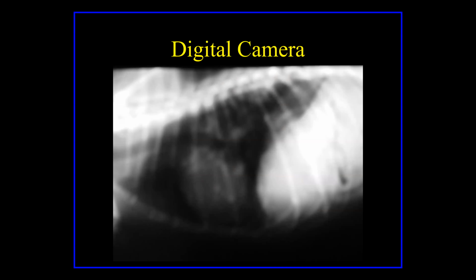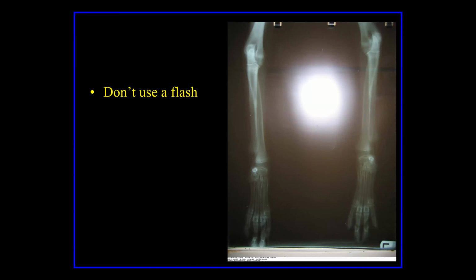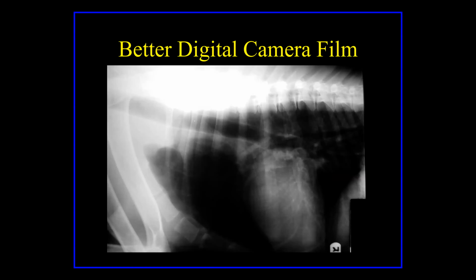Here's another winner. I can't tell you anything about this dog's leg. I can't even see his heart really. So, just crappy images. This one here, they decided they needed to use a flash on it, and so that's just a reflection of the flash bulb going off when they were trying to take this picture, which is kind of crazy. So it's just crap stuff.